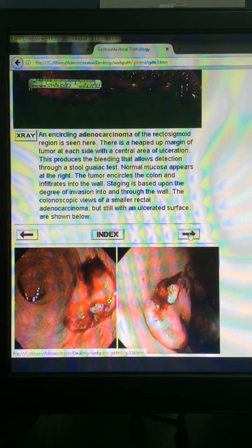Surface ulceration is a frequent finding in colonic adenocarcinomas due to friction with food particles, leading to loss of the surface epithelium and bleeding. The prolonged bleeding will lead to microcytic hypochromic anemia as one of the clinical features of colon cancer. So colon cancer or GI bleeding in general is considered one of the most common causes of iron deficiency anemia, especially in the elderly.